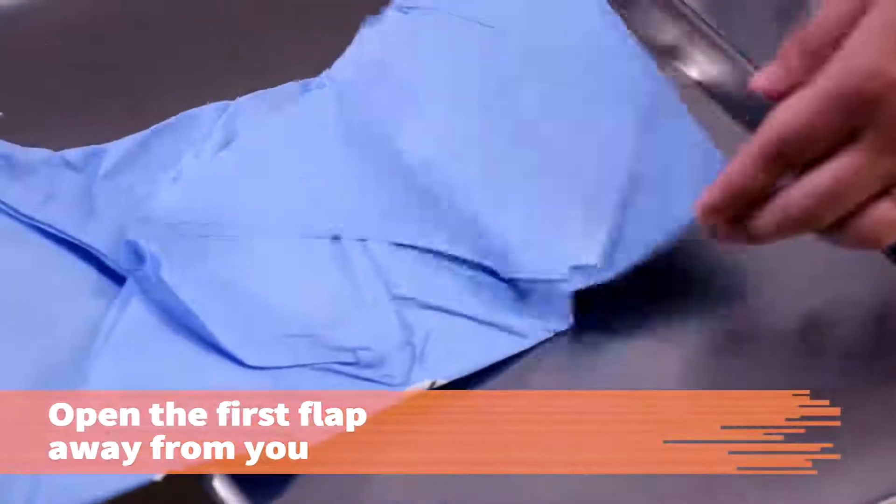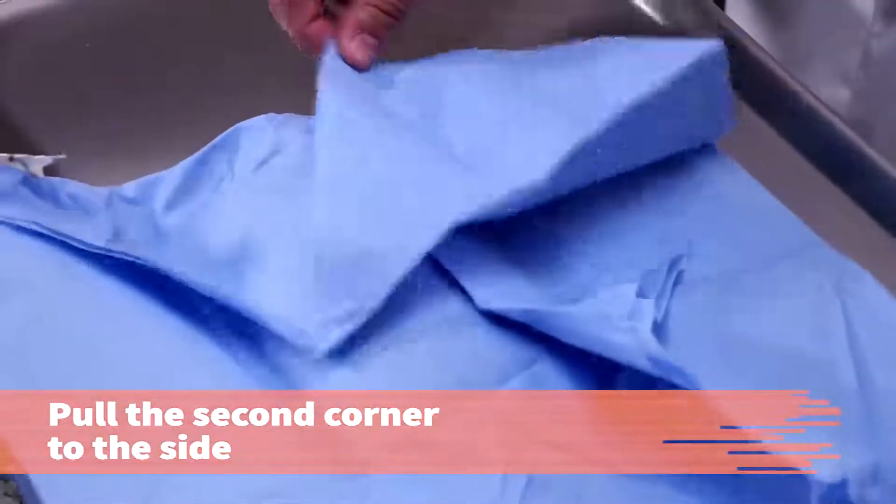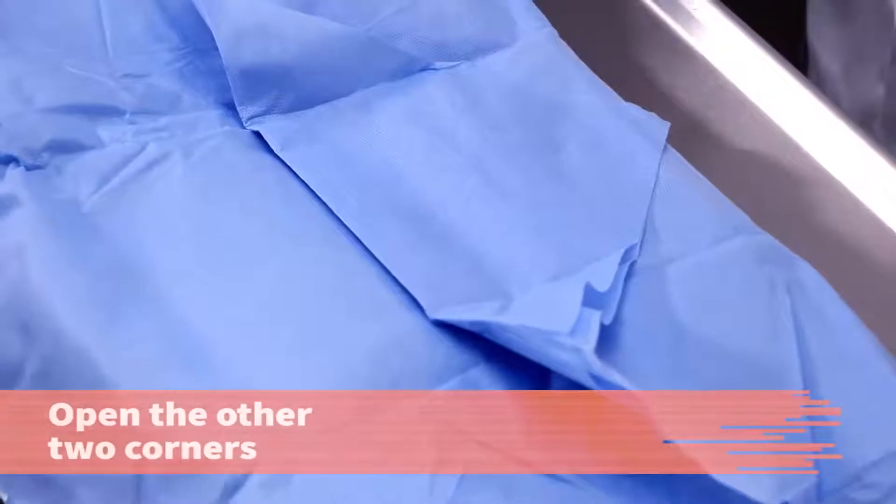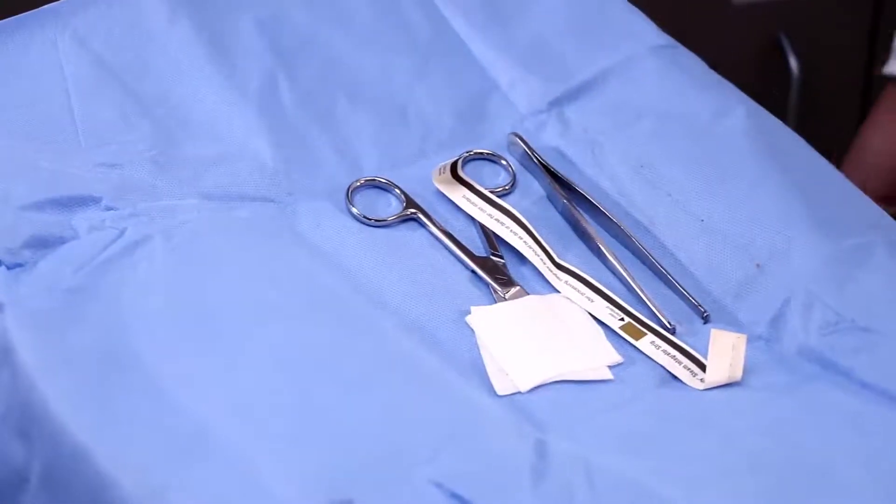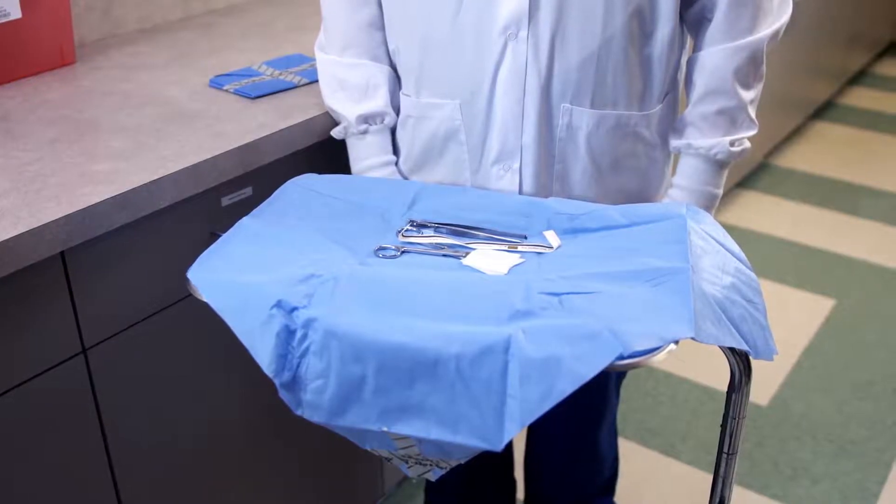To prevent contamination, open the second corner by pulling it to your left side. Open the remaining two corners of the pack. Your sterile drape is now a sterile field from which to distribute supplies and instruments.